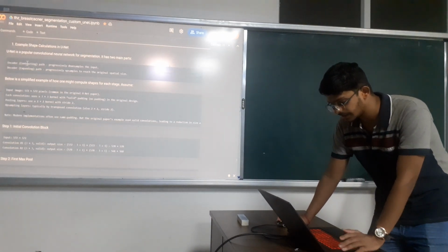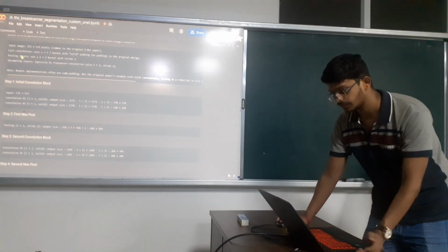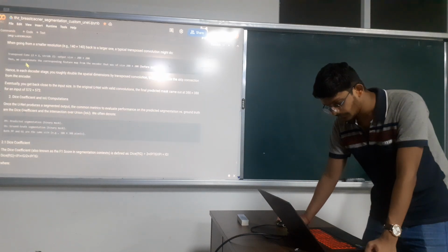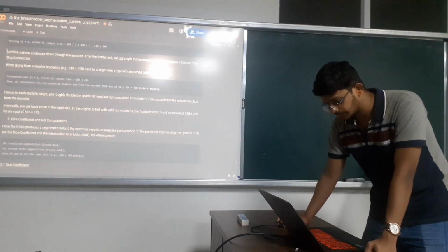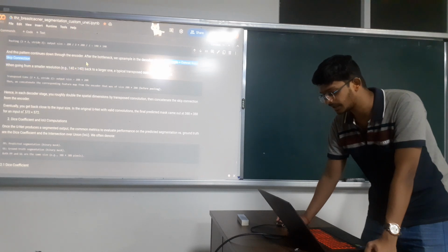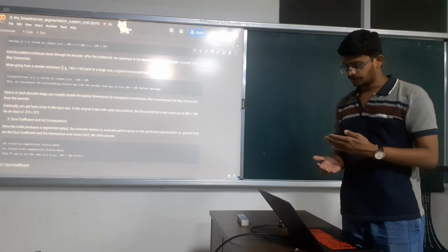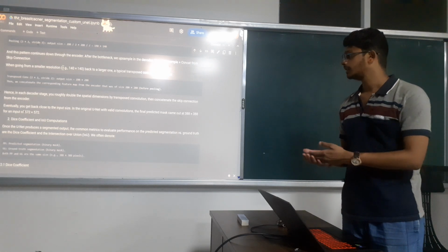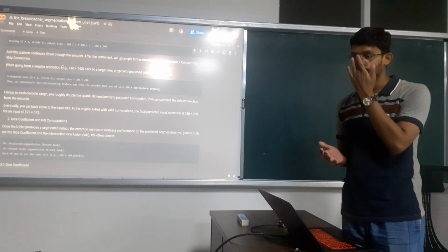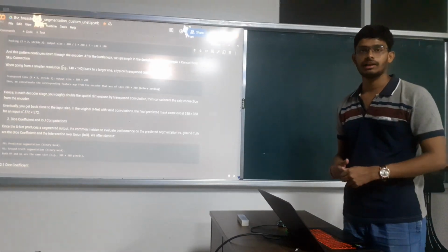So the UNet architecture, I have already explained: the encoder, decoder, the input image, convolution, pooling layers, upsampling and everything. And at the end, the thing that I had introduced here was the upsampling with concatenation from the skip connection. What the skip connection basically does is focus only on those blocks of the function where the features are more likely to give better results, like an attention block. It is a pre-attention block module that I have used here.